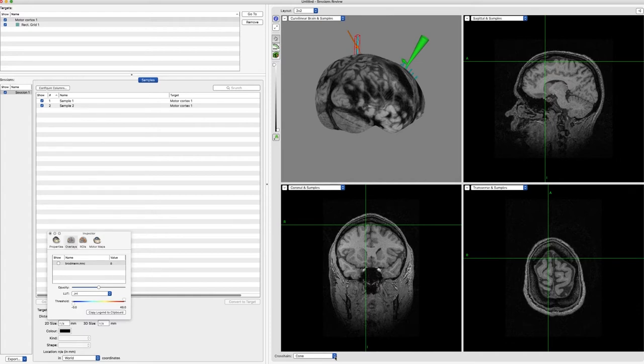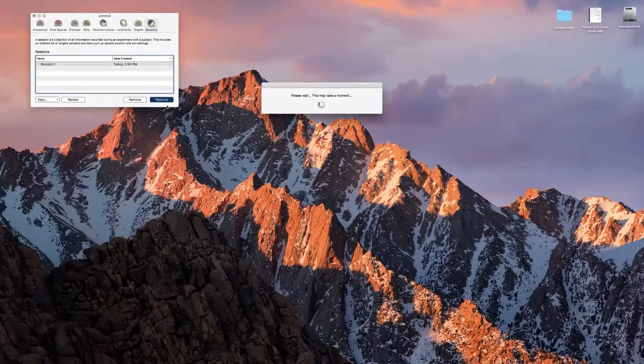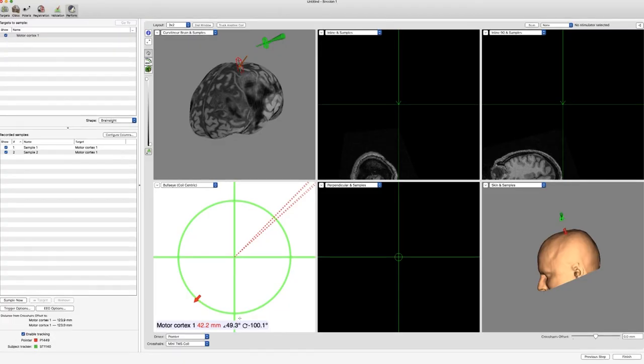So we go back to the session screen. You could have your driver there, set up as BF70, and you could change that. When you swap the coil in the stimulator, you change that to BF72. Yeah, so you want each coil to be calibrated, yeah.